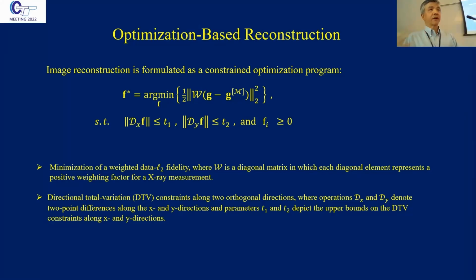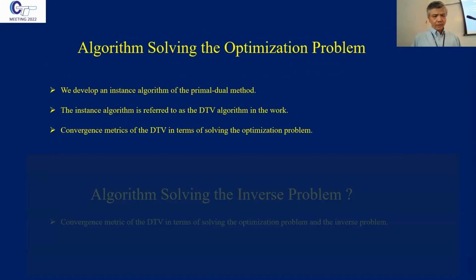And for this kind of convex problem, you can derive all kinds of algorithms to solve it. And here we love this primal-dual thing. So we derive an iterative algorithm from that approach to solve this problem. I already said that.